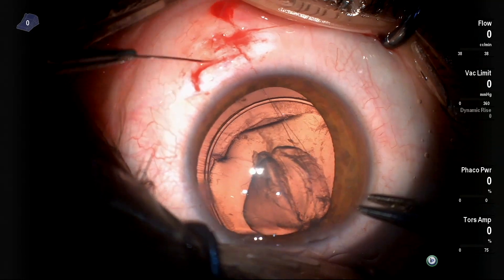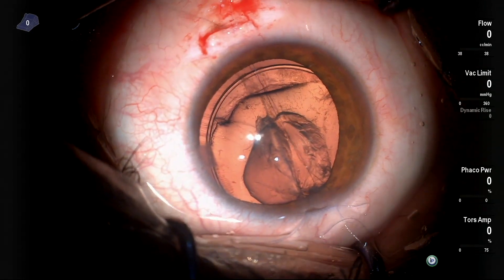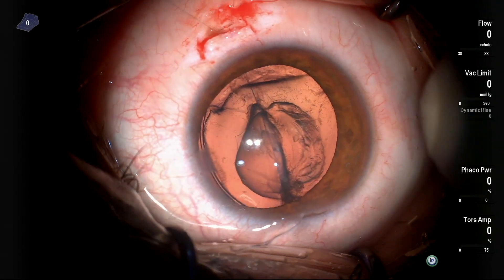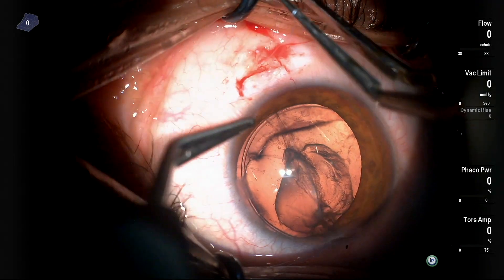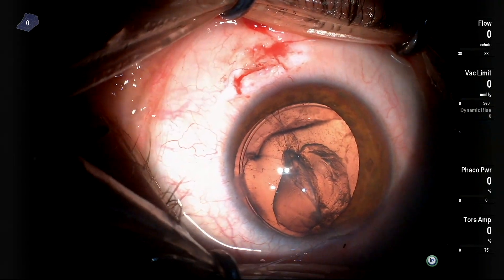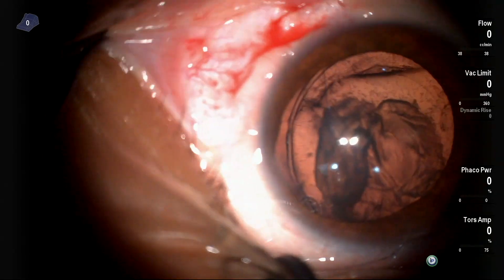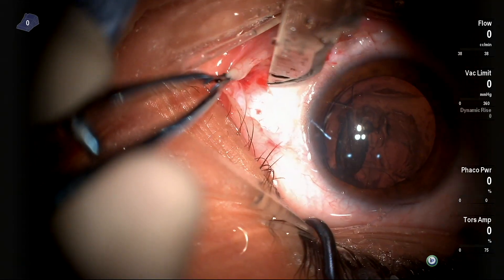I'm trying to keep the thread away from the capsular rhexis to avoid injuring the capsule. When you pull these threads, the CTR becomes more centralized. Then you cut the threads and tie the knot, which should be buried under the sclera — it's a slip knot or surgical knot that you control.